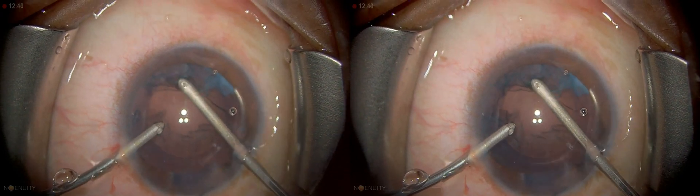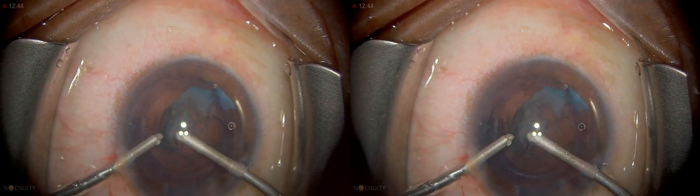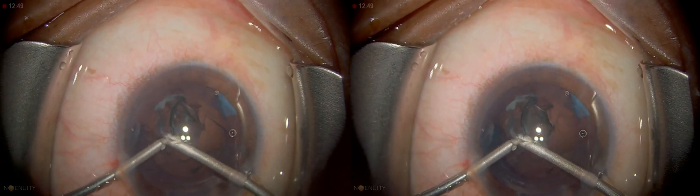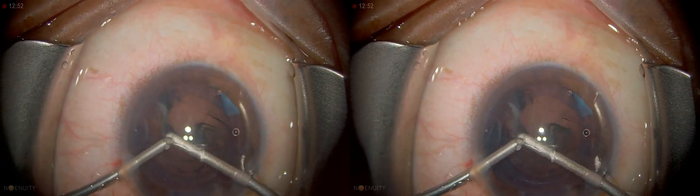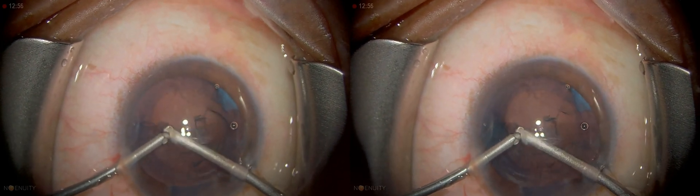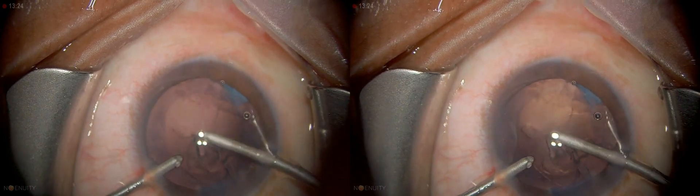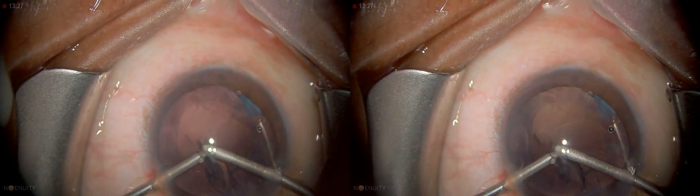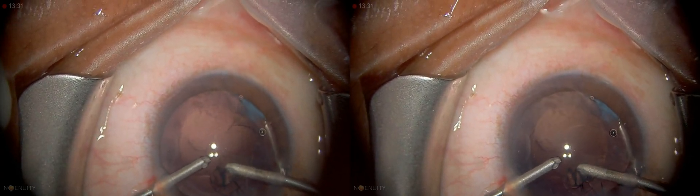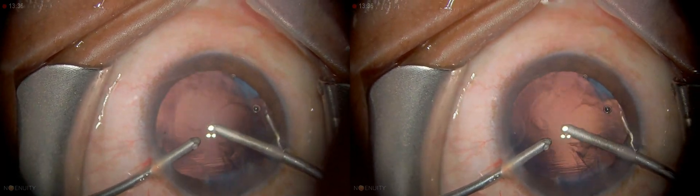Grasp the anterior skirt rather than the posterior one, then pull towards the center. If there is a little dense cortical matter, just nudge it in with the second instrument. The advantage of bi-manual is that you can really place the second incision sites at very comfortable positions, because the instruments are curved and any part of the sub-incisional area is totally accessible.